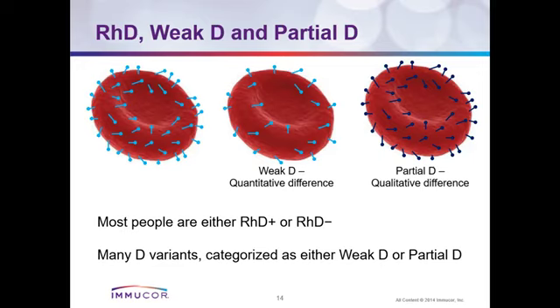So what do we do in our facilities in most cases? We do not differentiate between the true rhesus negative, the weak D and the partial D. In most cases, what we do is report both the weak D and the partial D as rhesus negative. And we are going to see the dangers of this at a later stage, the dangers of reporting weak D and partial D as rhesus negative, because we don't go ahead and confirm this.